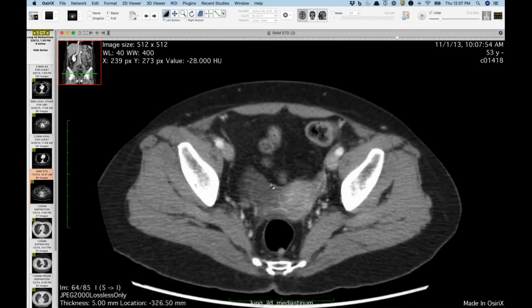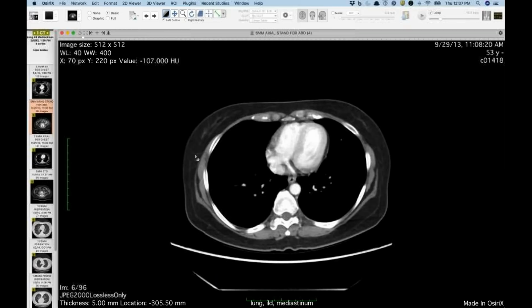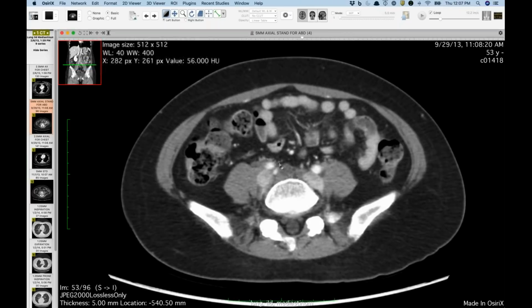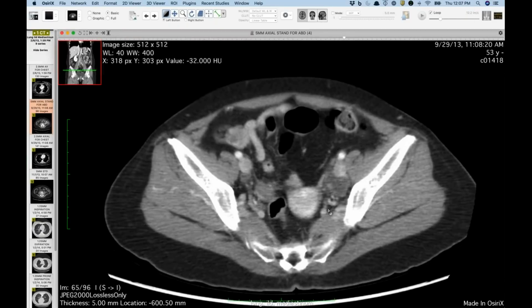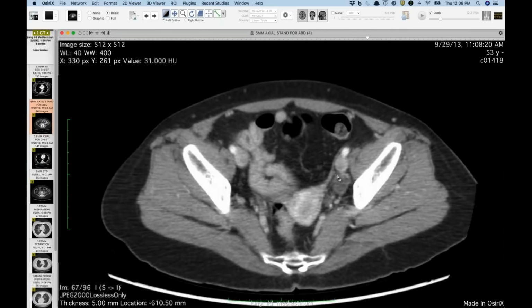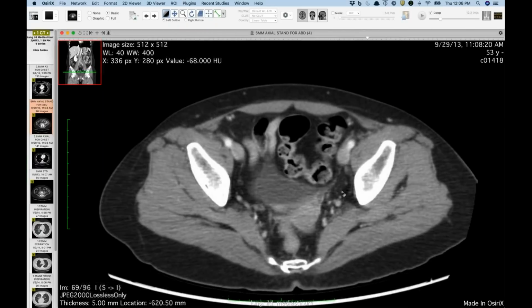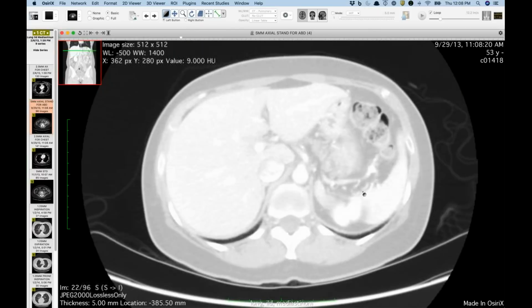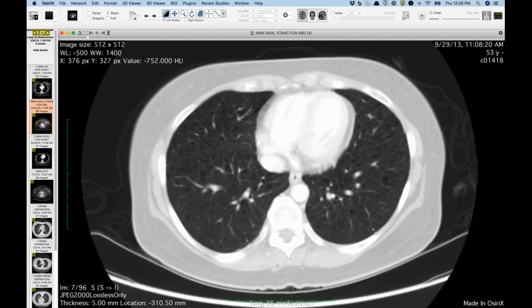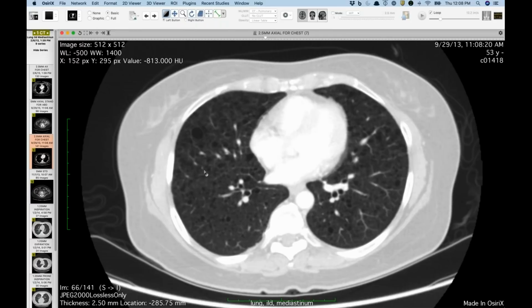Okay, so this is an interesting case. This lady had a few different abdomen and pelvis CTs at different times, and chest CTs. She had these pelvic lesions that you see, mostly low attenuation with a little bit of enhancement, and you can see some along the internal iliac chain and external iliac chain as well. They excised one of these, and I don't know the exact temporal relationship of all this, but it was a lymphangioleiomyoma, histopathologically. Her kidneys look okay, but when you look at her lungs, she was noted to have a bunch of little cysts, uniform, well circumscribed, thin walled cysts that are spherical. That prompted a CT of her chest, and several CTs of her chest.